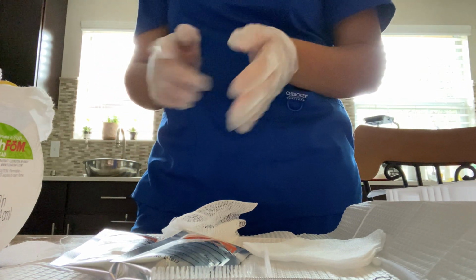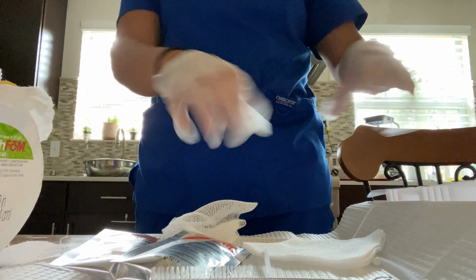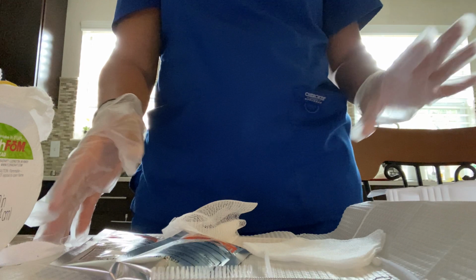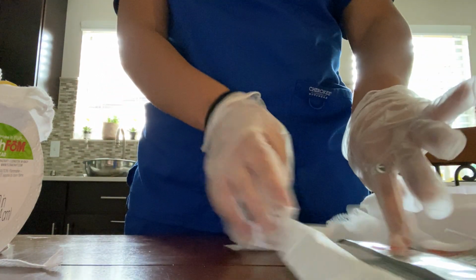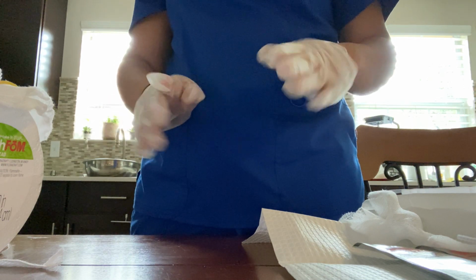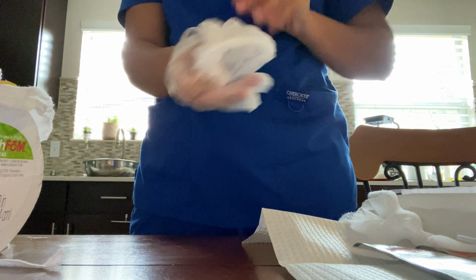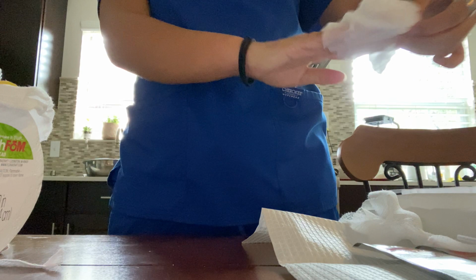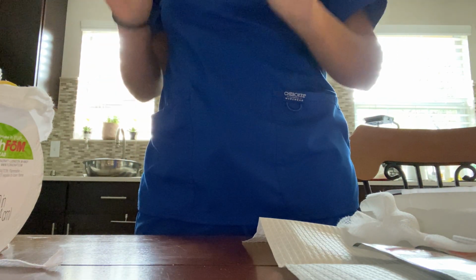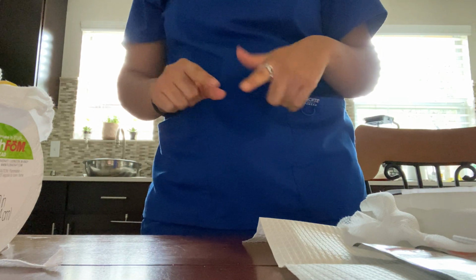I'm going to clean up everything. I'm going to gather everything with my gloves. Then you take them off, make sure everything is clean. So you're just going to clean that up, and all your areas clean, nothing is left out that's dirty. Then I'm going to dispose of my gloves properly, perform hand hygiene, make sure the call bell's in reach, the patient is good, and the patient knows you'll be back in 30 minutes.